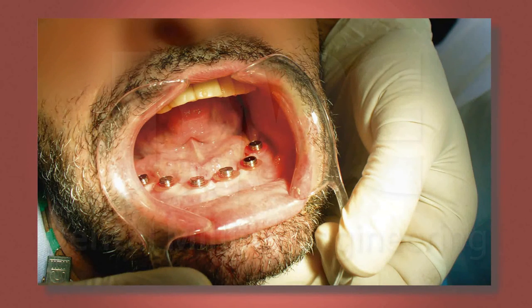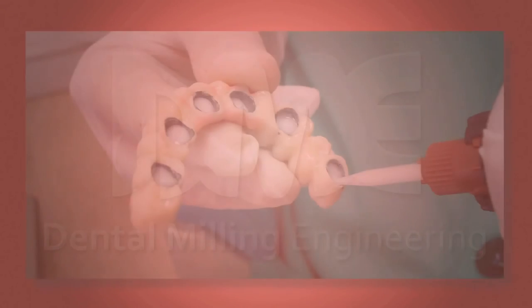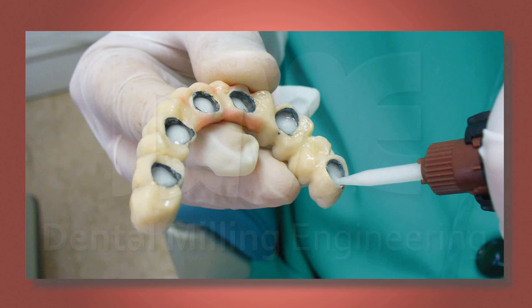With all the retainer holders placed, a visual inspection of parallelism is performed. In this step, we will proceed to cement the retainer holders to the prosthesis. We recommend using cement with fixing features that allow metal to metal. It is very important to place the retainer holders with red containers into the mouth and observe that the titanium retainers are perfectly parallel to each other.